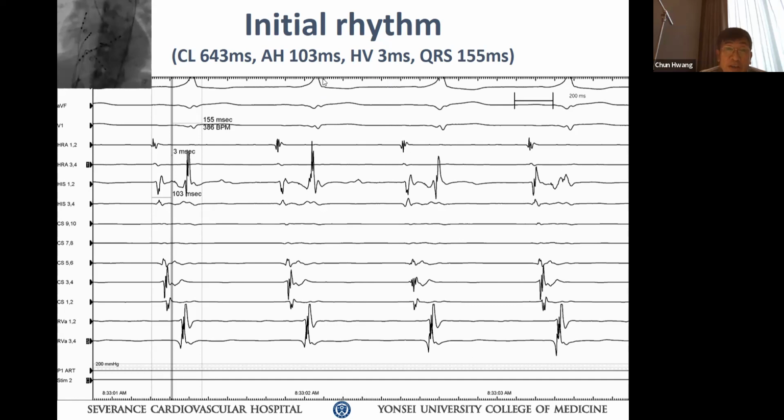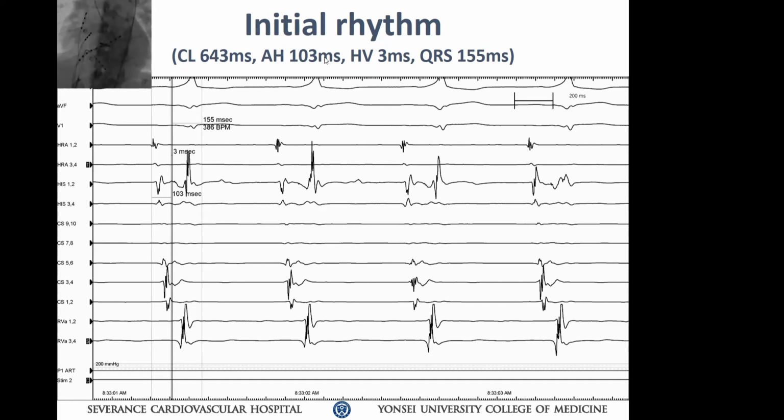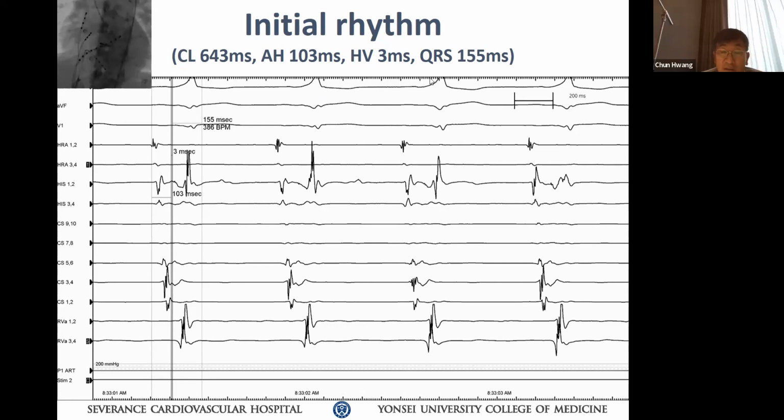Okay. So what you see here? 델타 웨이브가 관찰되고 있고, 좋다. 히스 번들과 HB 인터벌이 굉장히 짧은 확인. HV가 짧아? Hey, HV가 짧아? CS가 짧아? What are you reading?